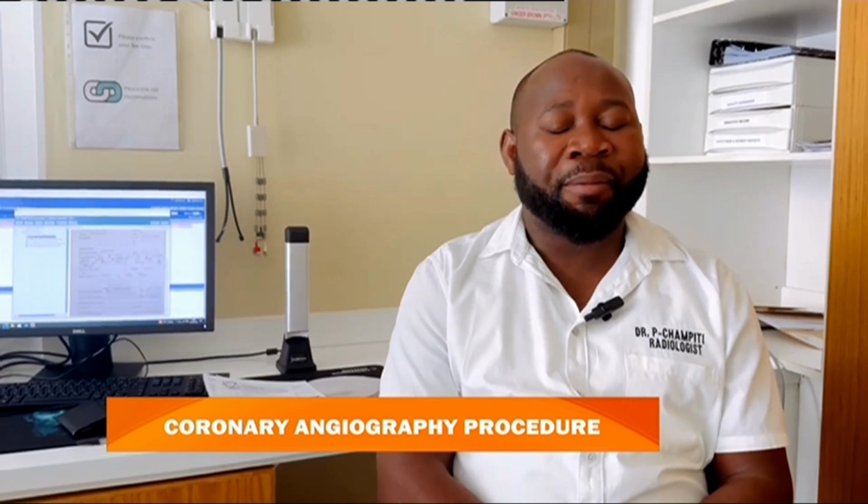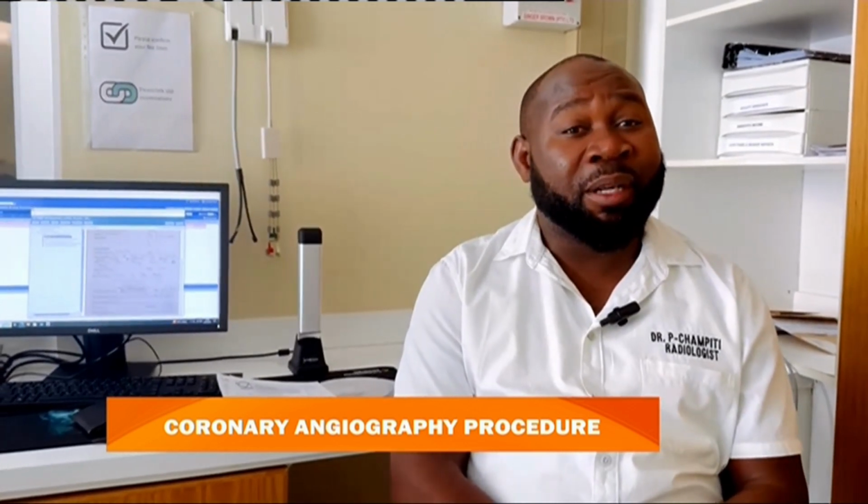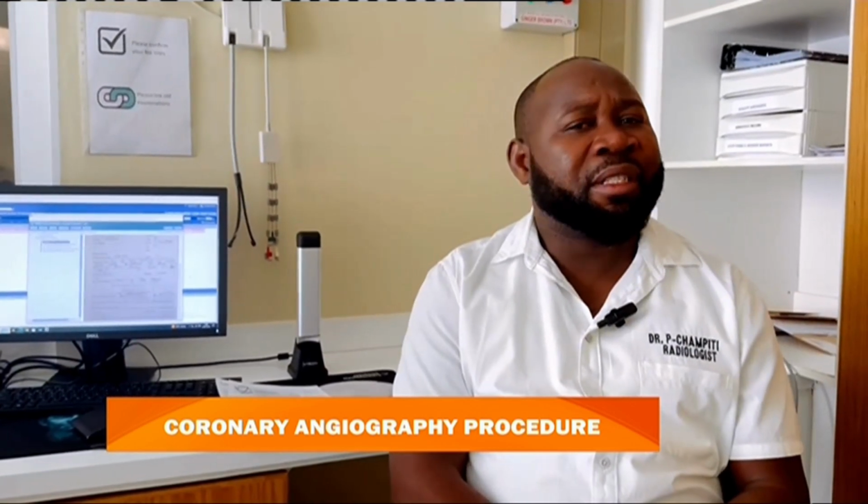And these include what is known as cardiac CT. This is where we are able to check what kind of calcium is in the blood vessels. Why is that important? Calcium predisposes to a whole lot of conditions, such as the heart attack we're talking about, such as the angina we're talking about, such as chest pain, because it actually blocks the blood vessels. It also helps to indicate that the person has got a blood pressure problem or other major systemic illnesses that we can think of.